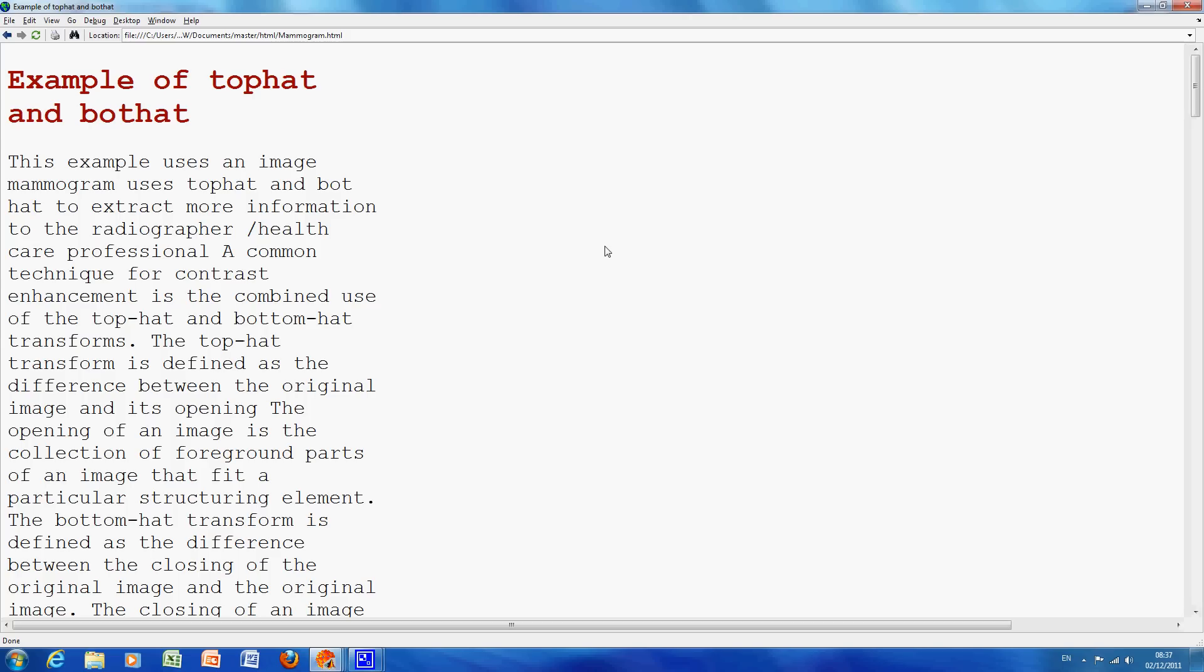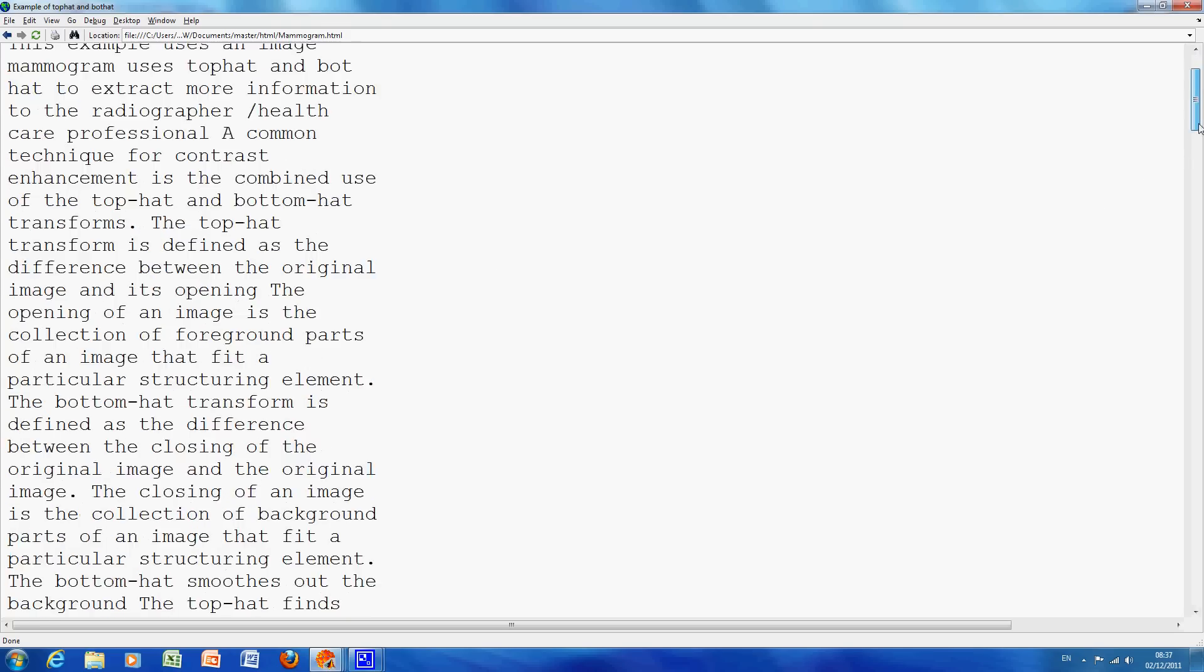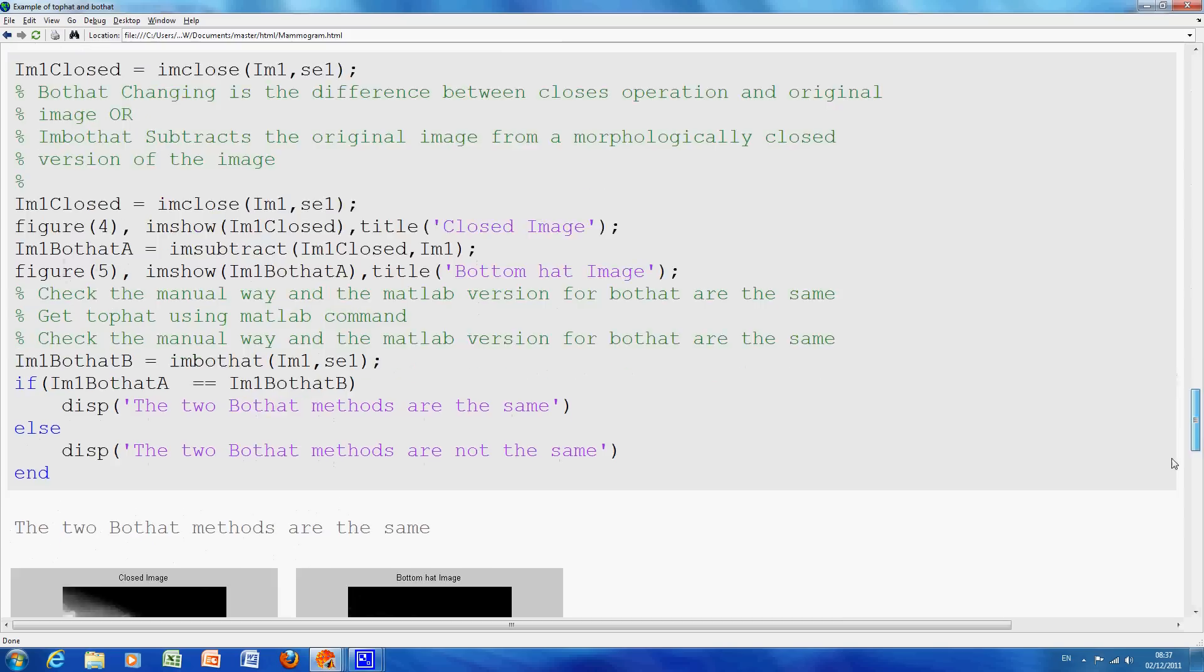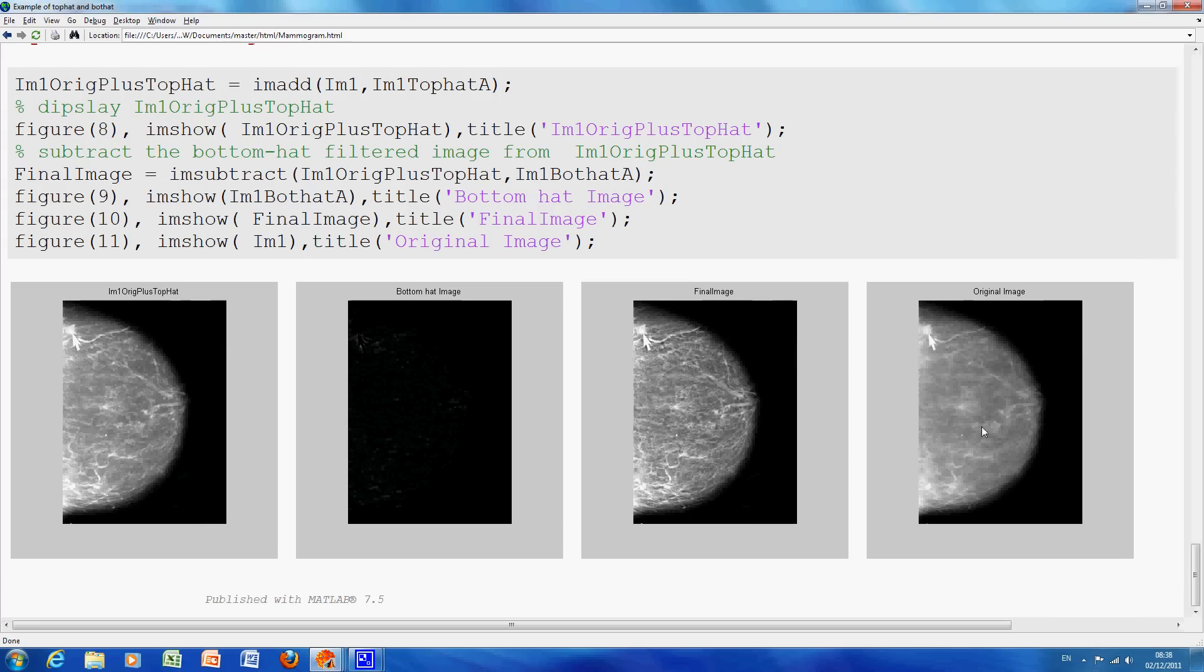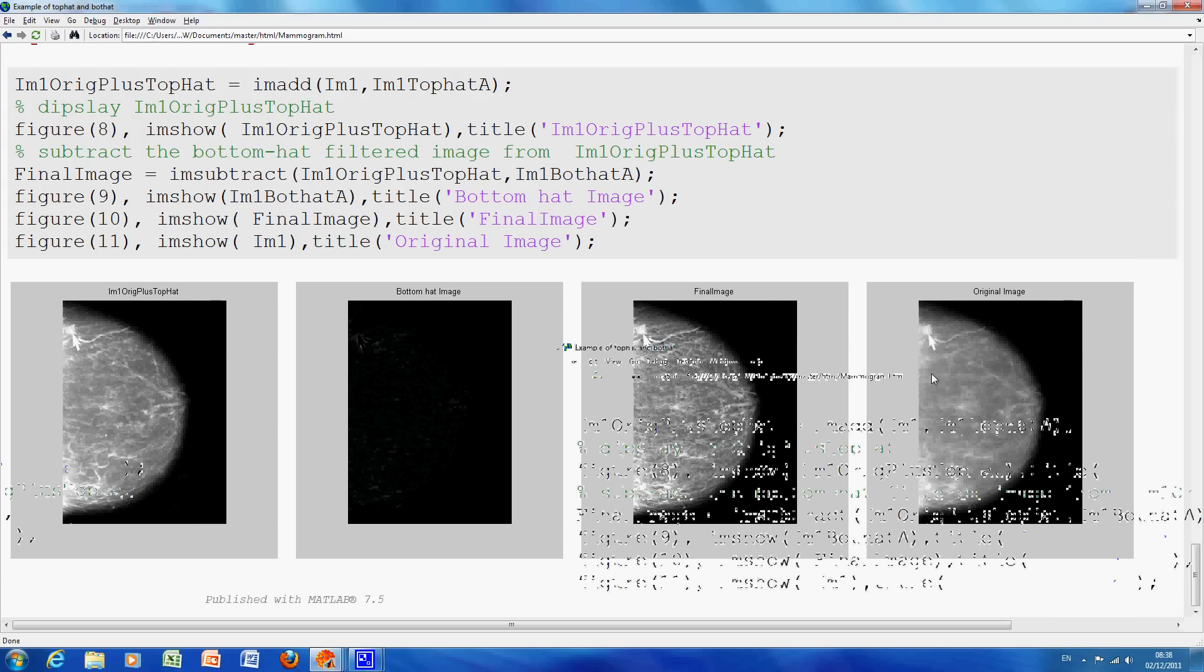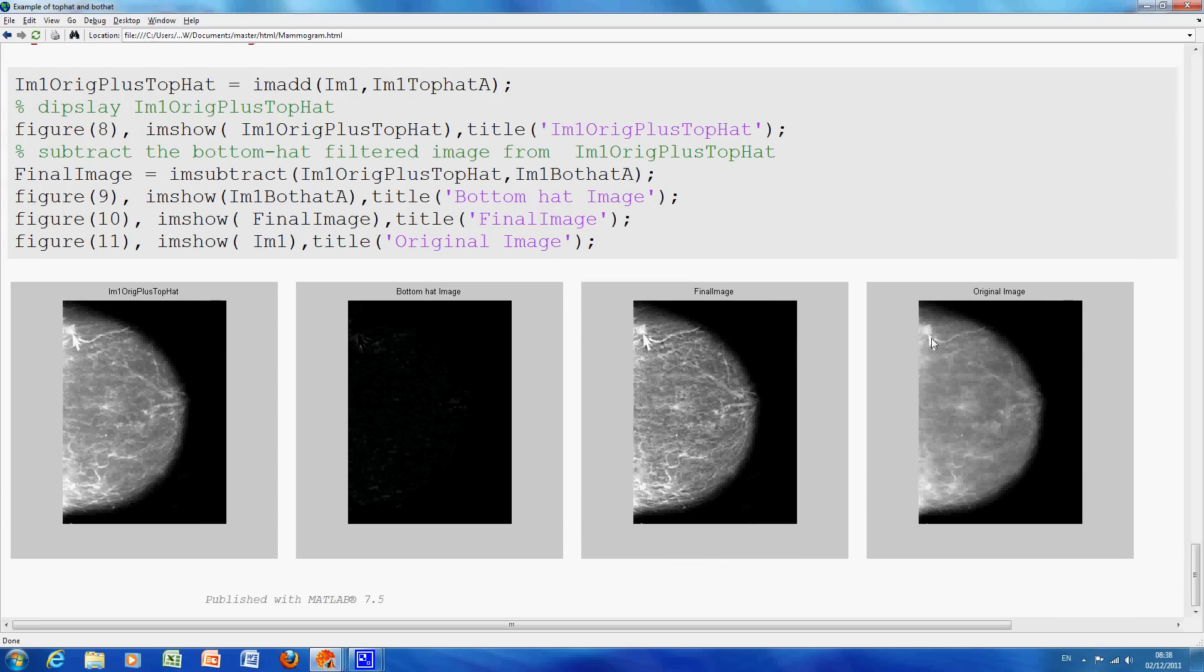We're using TopHat and BotHat, which is an advancement of morphological operations to enhance contrast in a mammogram. To give you some idea, just go to the very end. We have the original here, on the extreme right, you can see that we have the mammogram and where the screen capture is, where the mouse is pointing, there's a little white bit there, so that's a calcification.